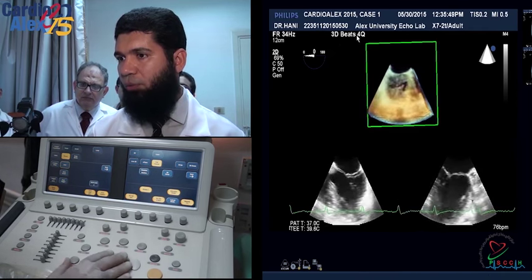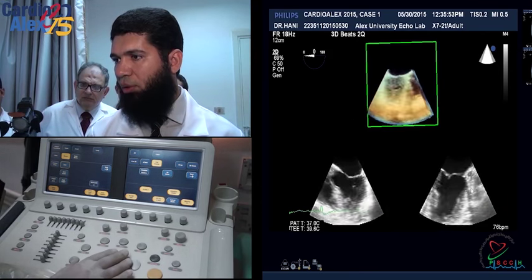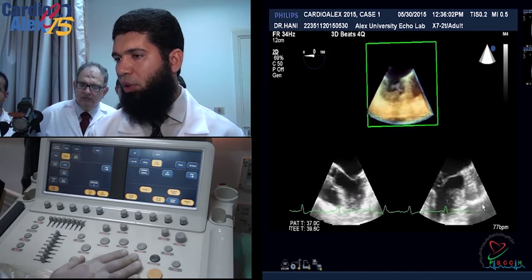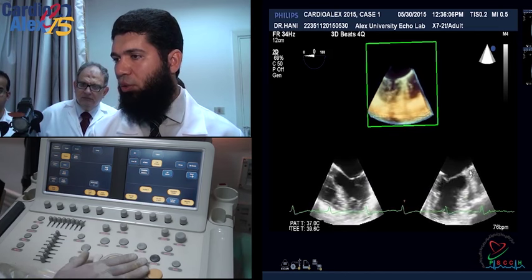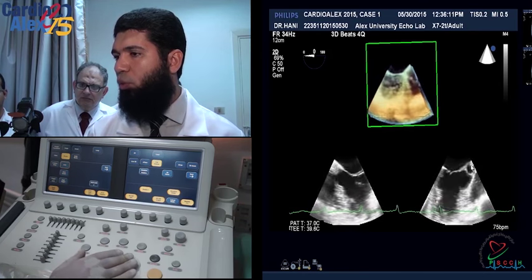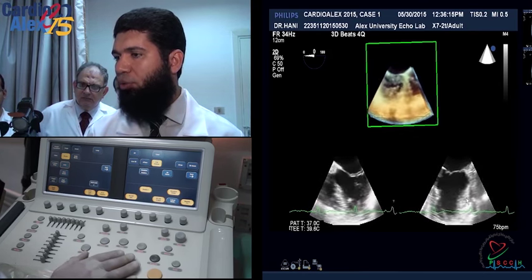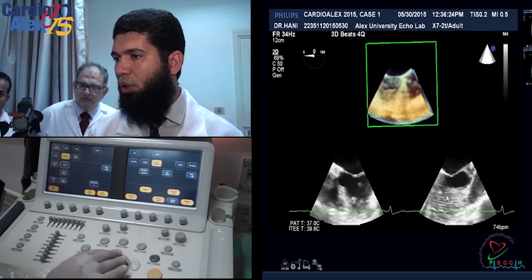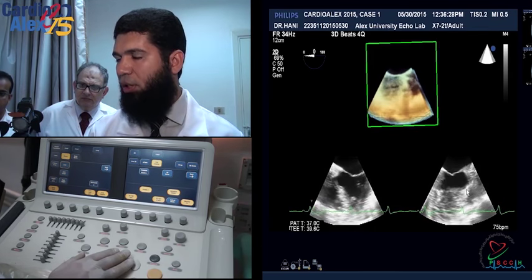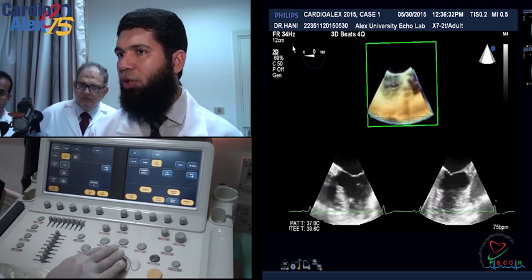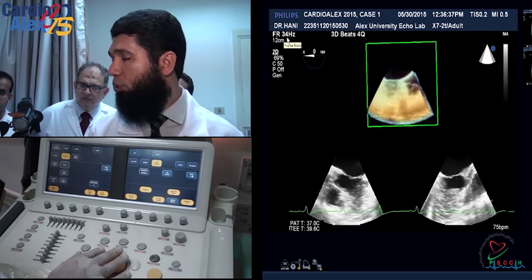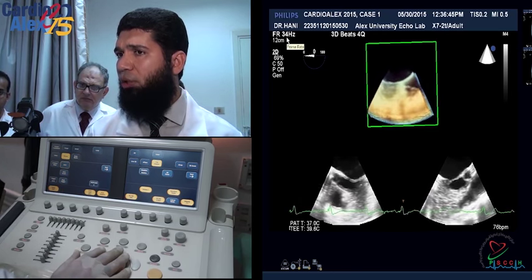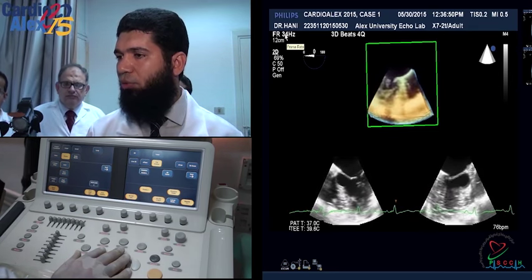The beat count appears on screen: 3D beats 4. If I decrease it to 2, the sector is divided into 2; increasing to 4 divides it into 4 sectors. On each beat, the machine takes one smaller sector, focusing all its power on that sector. The second beat covers the second sector, third for the third, fourth for the fourth — then the machine stitches them together. This creates demarcation lines called stitch artifacts, which are the drawback of Full Volume. The advantage is high frame rate: 34 volumes per second, which is very good for 3D.